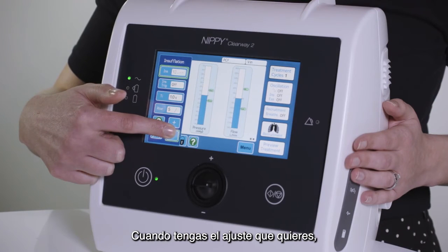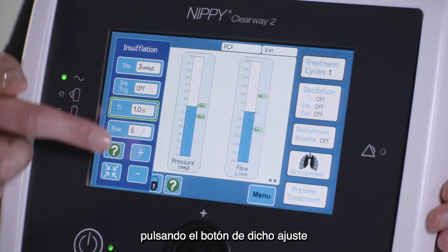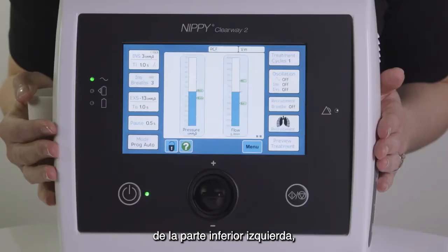Once you have the setting you require, you can either select a different setting to change by pressing on the button of that setting, or close the window by pressing the minimise button in the bottom left of the window, or by pressing outside of the window.